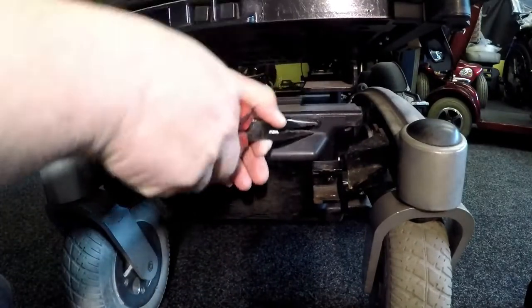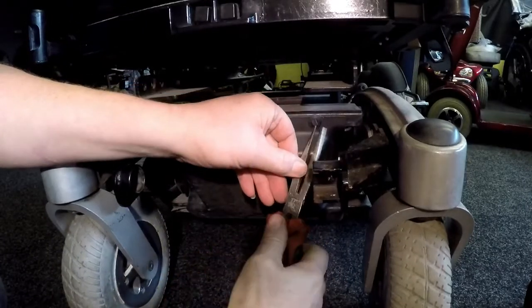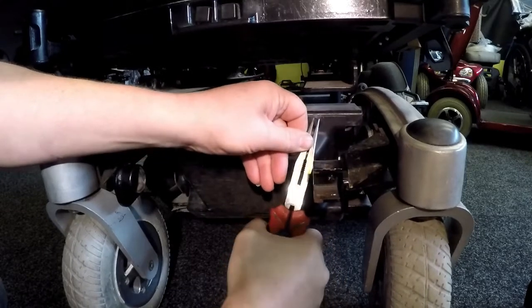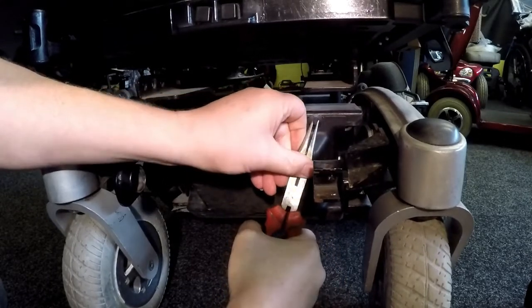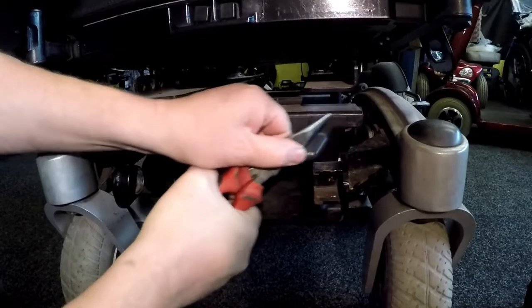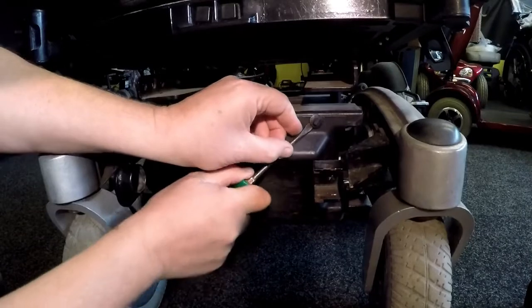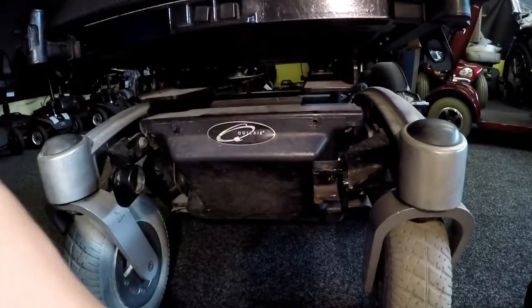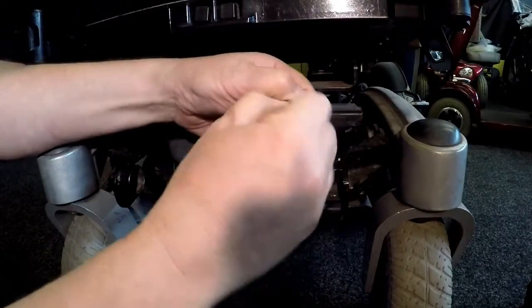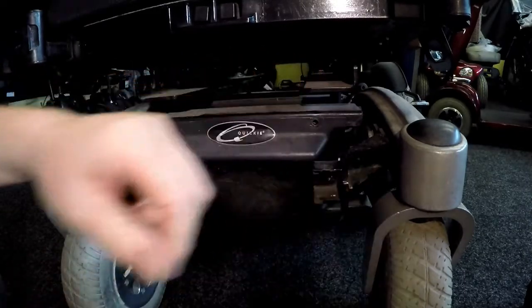These are just wee plastic grommets. Getting there. Not the best. Those will need to be replaced. There's one out. That's how it looks here. The middle bit's supposed to slip out. Been in for a while. Middle bit slips out and it spreads that in there.